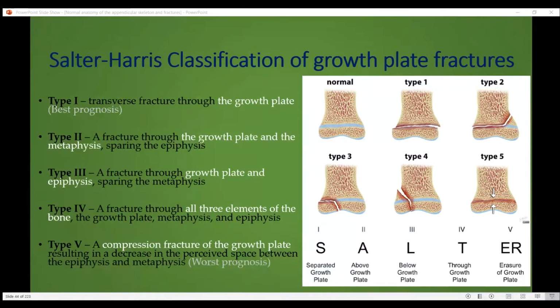So their bones will look low and smaller, with only a few zones of calcification, but not all the zones of calcification. So generally, we cannot take the dwarf to be the adult itself. There is a different evaluation related to dwarf bone problems.